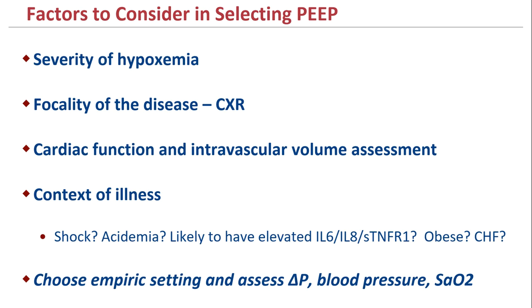Obese patients, compliance is something you need to keep in mind when you talk about plateau pressures as a limit. CHF, high PEEP, definitely would help.